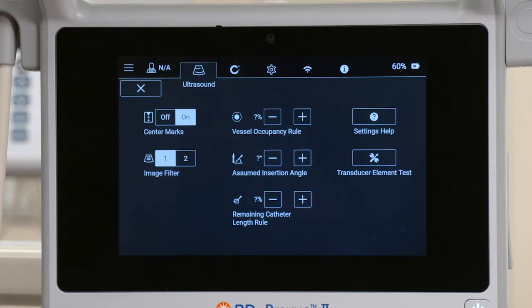Follow institutional guidelines where available when selecting each setting. Adjust the vessel occupancy value to set the desired maximum vessel occupancy of the catheter based on diameter.